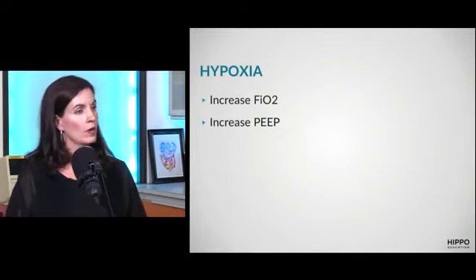Yeah, I like to think of the PEEP as, if this is your alveoli and it's completely collapsed, there's no air in there for the oxygen exchange. If you've got that PEEP, you're just keeping that little grape open. And so there's always oxygen, so you're going to increase that movement of oxygen across that membrane. Exactly. And in fact, allowing the alveoli to fully close and rub against each other is harmful to them. So we always want them to be open a little bit, even on a physiologic basis as well as an oxygenation basis.